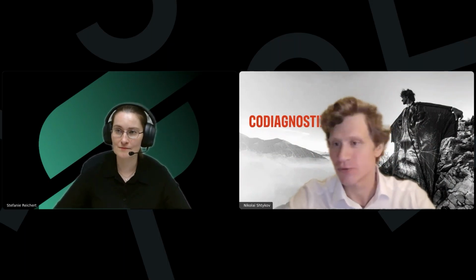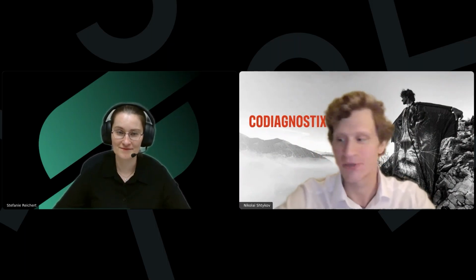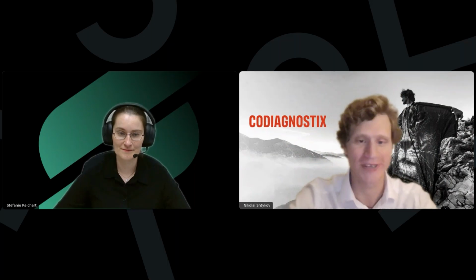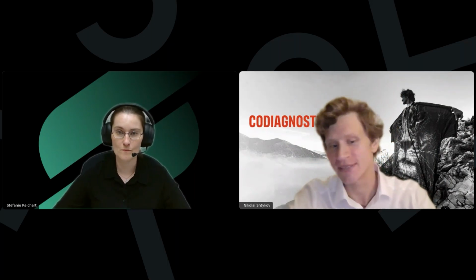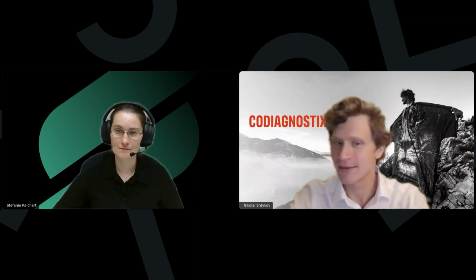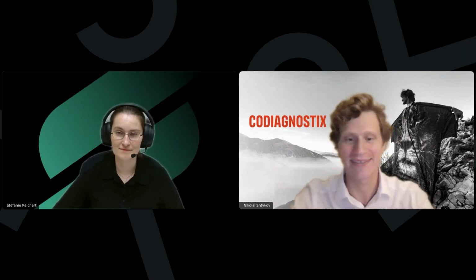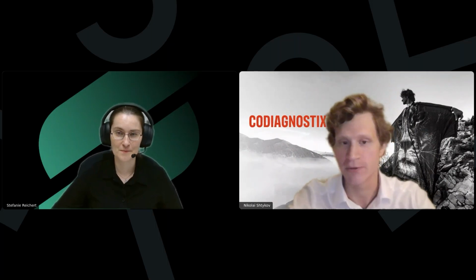It was a pleasure to read your questions and respond to them, and to be helpful for you and enjoy the new features of coDiagnostiX. This is our tool, which has given us the ability to create really challenging cases, easy cases, and of course challenging cases. And no one in the market can do these challenging things as we can. So I'm happy to share this experience with you.